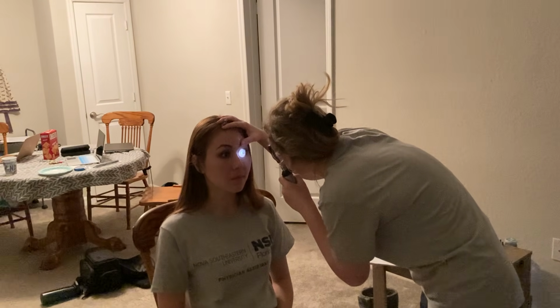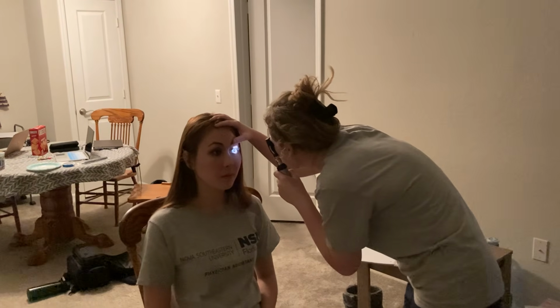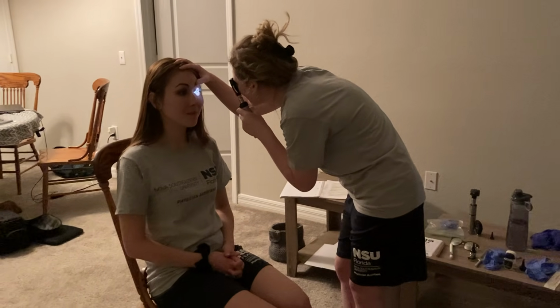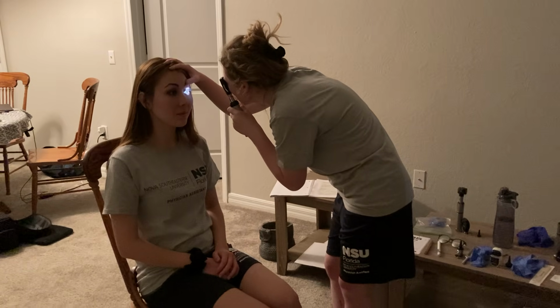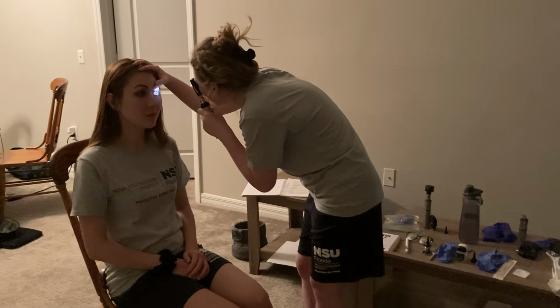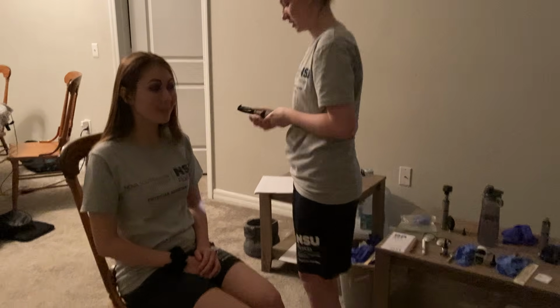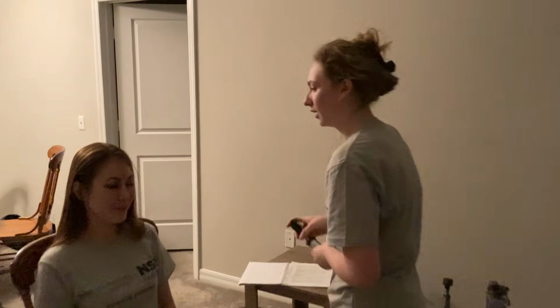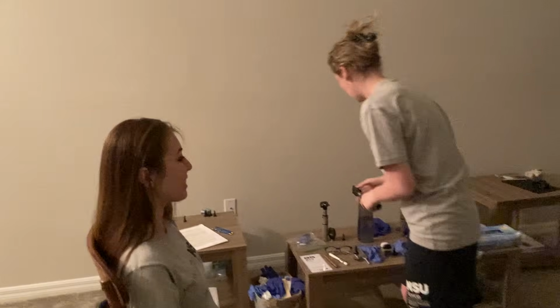Additionally, I'm going over my 4 quadrants again, and I see some very beautiful veins. I see the AV ratio is 2 to 3. I see again no nicking or no spasms, and I see no hemorrhaging. Additionally, I see no exudates. I'm going to have you one more time look directly in my light. And perfect, no macular lesions in your left eye as well. Okay. So that concludes our fundoscopic exam.